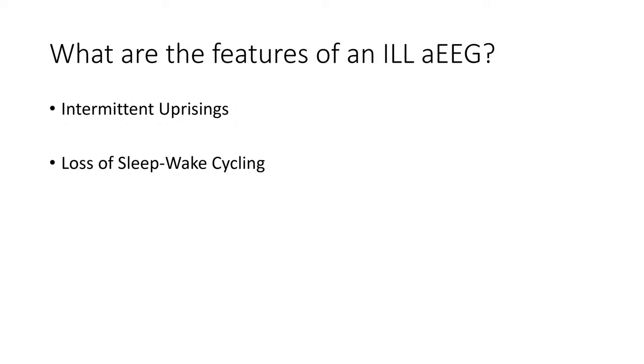So this begins to tell me that the brain is not tolerating that level of hypoxia, and that maybe it's time to have a conversation about that. Adding on NIRS can give you some kind of secondary backup for those kids, especially where you can say, I'm seeing this lack of sleep-wake cycling. What's the actual brain saturation? Although systemic sats may be good, you'll be surprised how low the cerebral sats are. And that can, again, help have a conversation with that.